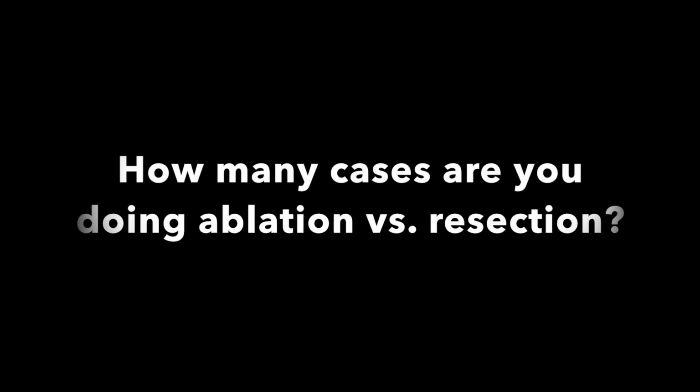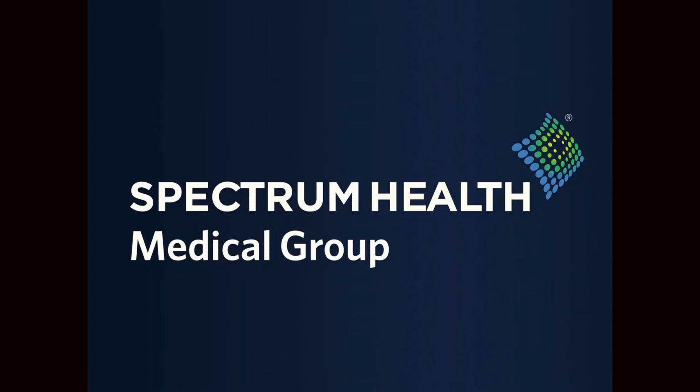How many cases are you doing, ablation versus resection right now? Ablation is still limited. Most of our ablation is done in the setting of metastatic cancer patients who have already undergone radiosurgery or radiation therapy and are progressing despite that. Those are the majority of the ablation cases, but we do occasionally do it for epilepsy patients such as this, or periventricular heterotopias, those are deep lesions. So we've done those cases. Hypothalamic hamartomas, another good case where the laser really diminishes the morbidity of that procedure. And we've used it for the amygdala and hippocampus as well.